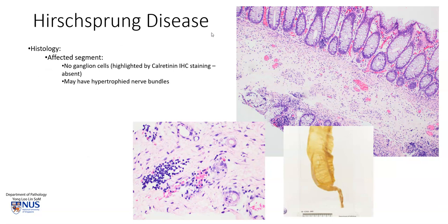There will be a separate talking slide on the microscopic features of Hirschsprung disease, but just in a nutshell, the affected segment will have no ganglion cells, both in the submucosal plexus as well as the myenteric plexus in the muscularis propria. Here we have colonic mucosa, submucosa, and there are some prominent nerve bundles in the submucosal region. However, there are no ganglion cells, and this is what we would see in the aganglionic shrunken segment.